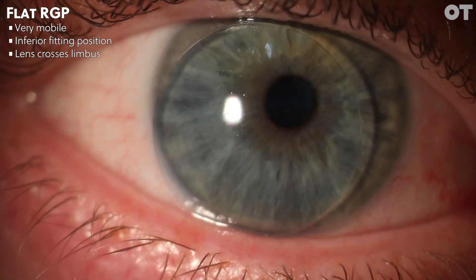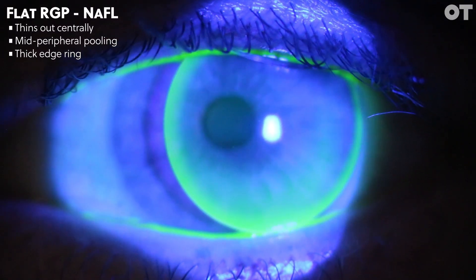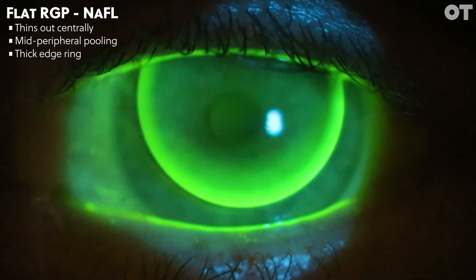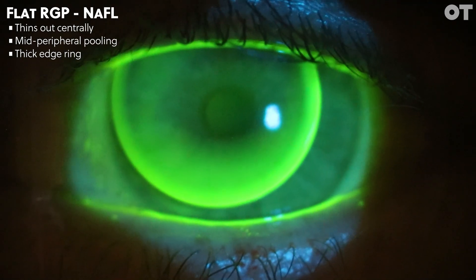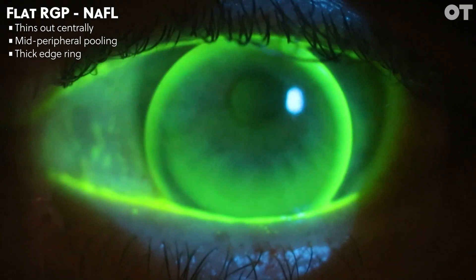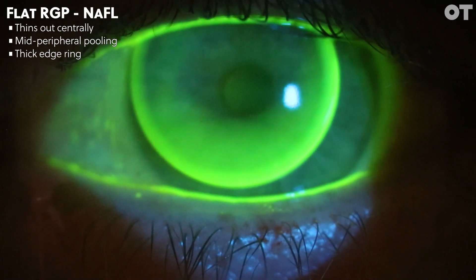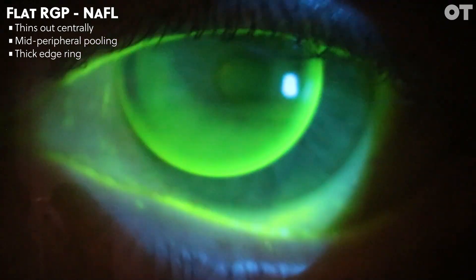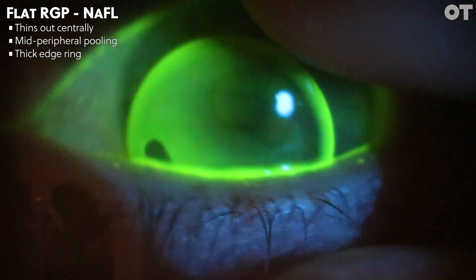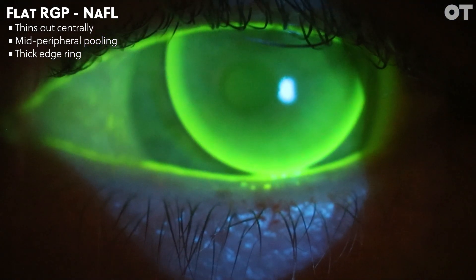You would tend to expect a flat fitting lens to need more plus than expected on the over-refraction. Here we can see the fluorescein pattern of a flat RGP contact lens. Again, we split the lens into three zones and consider the central zone first. We can see the fluorescein thins out centrally, so we're looking at a lens bearing on the central apex of the cornea. Mid-peripherally, we can see an area of pooling where the lens is sitting away from the mid-peripheral cornea. We also have a thick ring of fluorescein around the edge, indicating excessive edge clearance. These lenses are very easily removed, and quite often the patients can find the lenses spontaneously flip out of the eye.